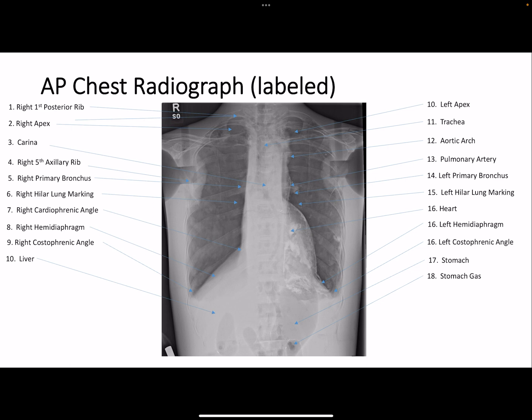Anatomy demonstrated. Anatomy demonstrated are both lungs from the apices to the costophrenic angles, and the air-filled trachea from the T1 down. The hilum region markings, the heart great vessels, and bony thorax are all demonstrated. Items in profile. There are no items in profile.